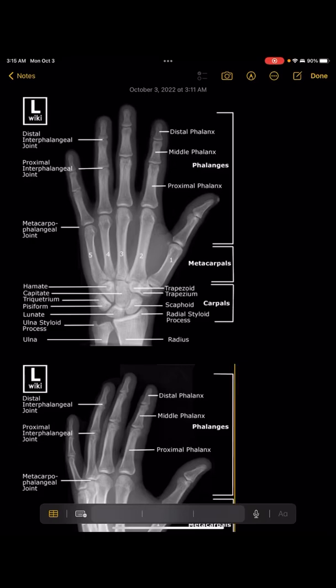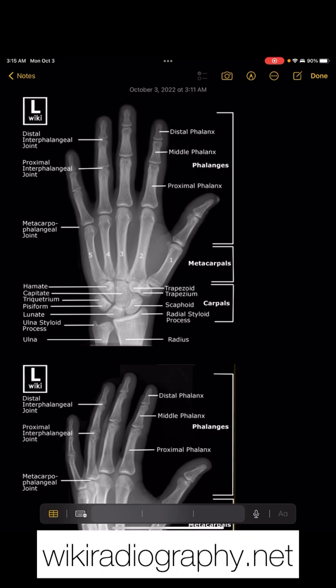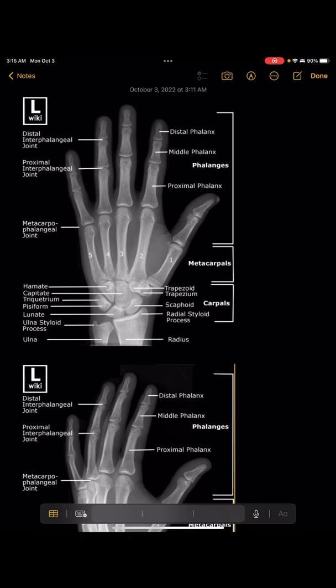This video is going to be kind of an image-heavy review. I got these images off of wikiradiography.net, so hopefully they are okay with me using them as a teaching tool.